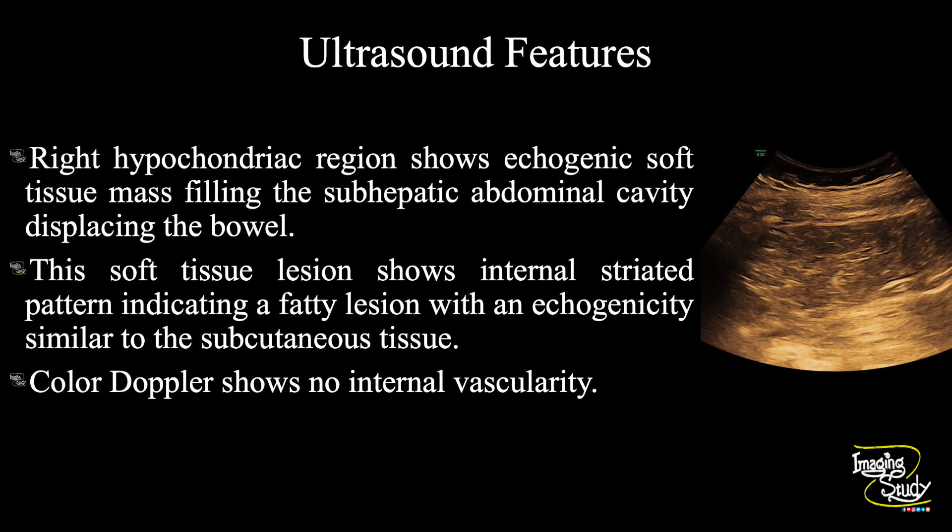In summary, the right hypochondriac region shows an echogenic soft tissue mass filling the subhepatic abdominal cavity, displacing the bowel. This soft tissue lesion shows an internal striated pattern indicating a fatty lesion, with echogenicity similar to the subcutaneous tissue. Color Doppler shows no internal vascularity. These features conclude it as a case of abdominal lipomatosis.